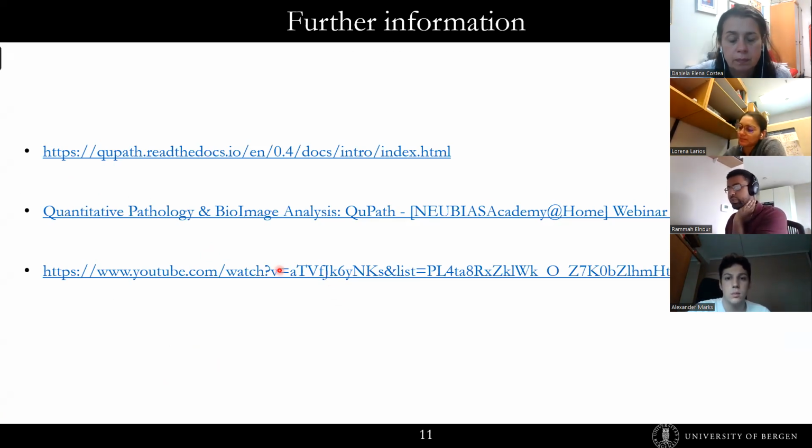And he's also done a recent presentation just giving background information about the software that you can also access. And he also has these documentation files that explain the different steps or the different functions that you have in QuPath. So these are some of the resources that you can look into, Alexander, that might help you to start what you're going to do in QuPath. But if you have any questions while you're doing your analysis, obviously just let me know and I will do my best to help.